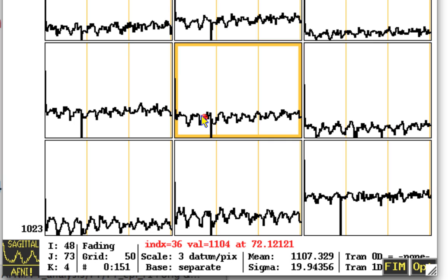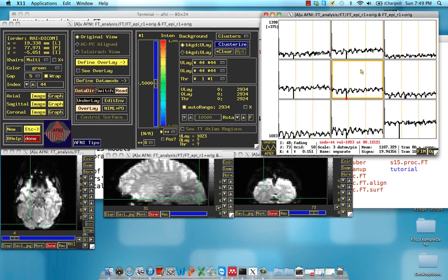Besides that, if you click a little further along here, and if I'm just clicking the right arrow key as I go along here, notice that there seems to be a pretty obvious dip right in here. So I keep going, and notice what's going on down here as I'm going across. Okay, it seems like there's a pretty significant head motion during that one acquisition. So we might need to be aware of that. This should be taken care of by the 3D volume registration step.